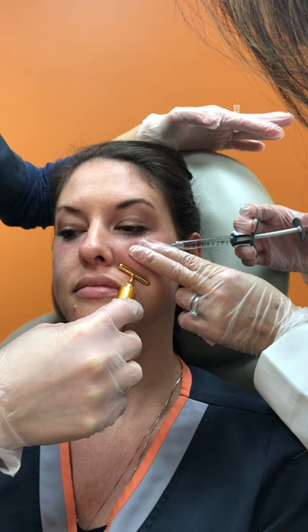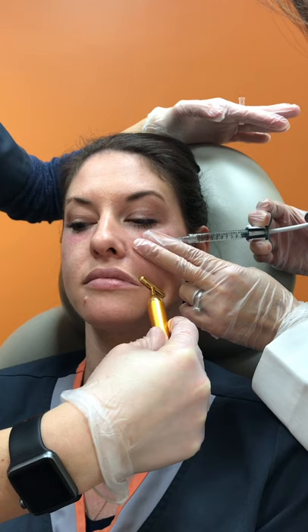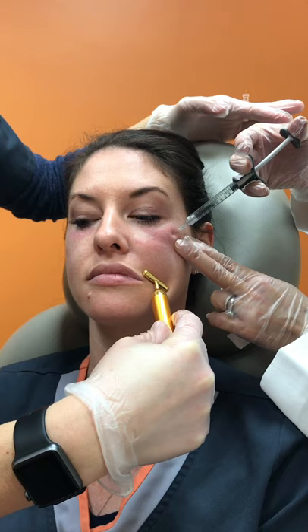We do a fanning technique back and forth along the cheek to enhance the volume and essentially lift the cheek. I'm always keeping my cannula going back and forth so I'm aliquoting the product evenly, as well as to avoid injuring and getting into any nearby vessels.